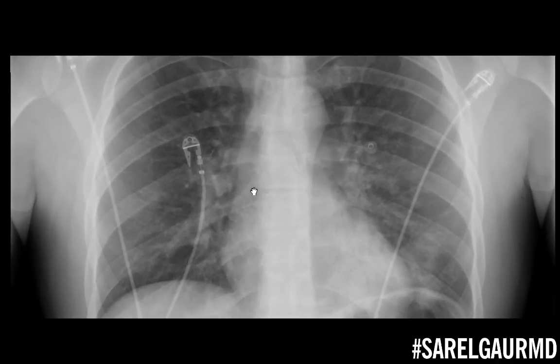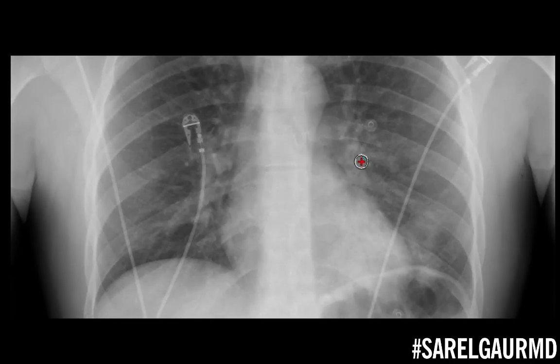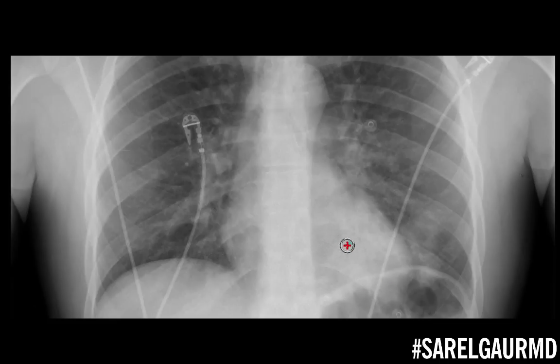Let's look here in the left lung base. There is this ill-defined airspace opacity here, and this is a pneumonia — what we would call a retrocardiac pneumonia. If you look very closely right here, you can actually see a faint air bronchogram, and that only shows up if the surrounding lung is filled with fluid.